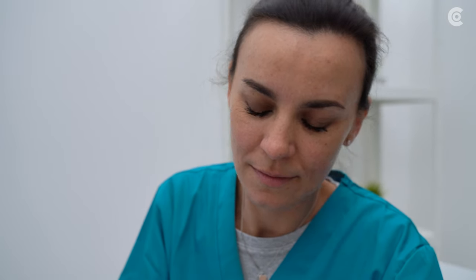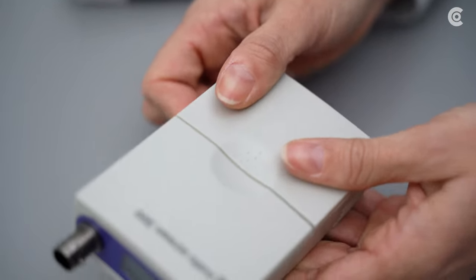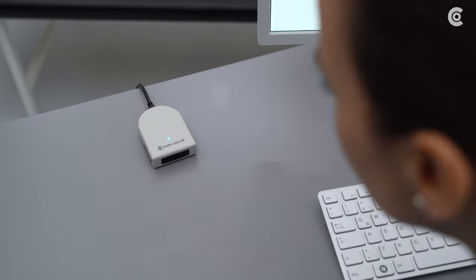First, insert three AA batteries into the blood pressure monitor and make sure that the infrared interface CustoCom IR is connected to the PC via USB.